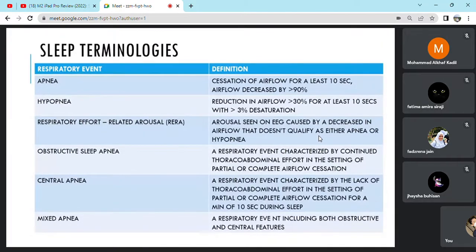Usually, if a patient is suffering from obstructive sleep apnea, you will see thoracoabdominal efforts. Okay? Makikita mo yung chest at saka abdominal belts that you usually place for your patient. And you will see that the patient has an effort. So makikita mo yung marirecord mo, yung electromyogram, I mean the muscle movements that you see will record that the patient is trying to correct now the apnea.